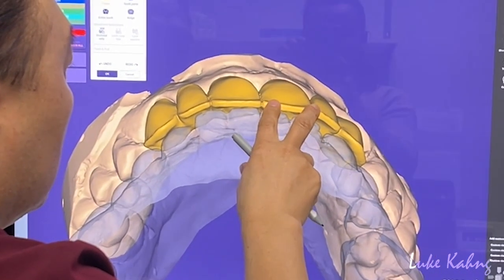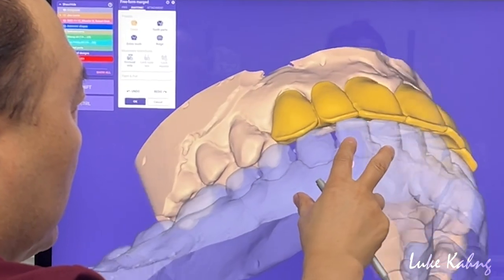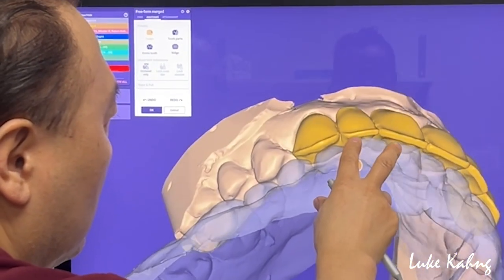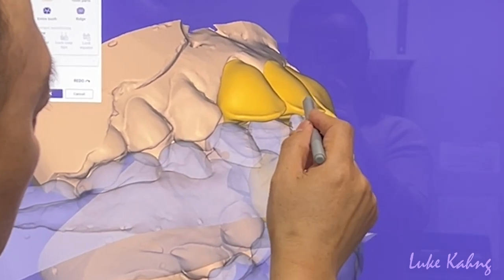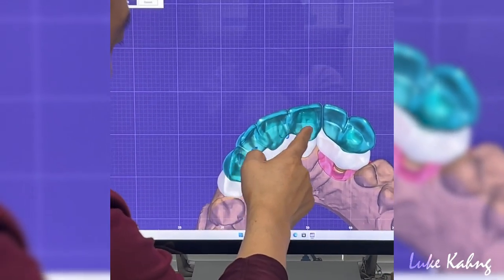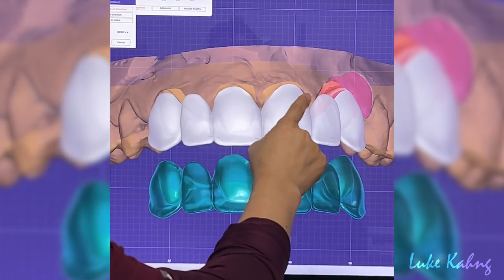I have to increase the value because the adjacent teeth have a high value, so I don't have to put so much force. I'll give them the strength especially here so I can get a full contour. What I like here is I need to put it thicker, thicker, thicker — cantilever bridge with canine, implant — thicker. That's good.